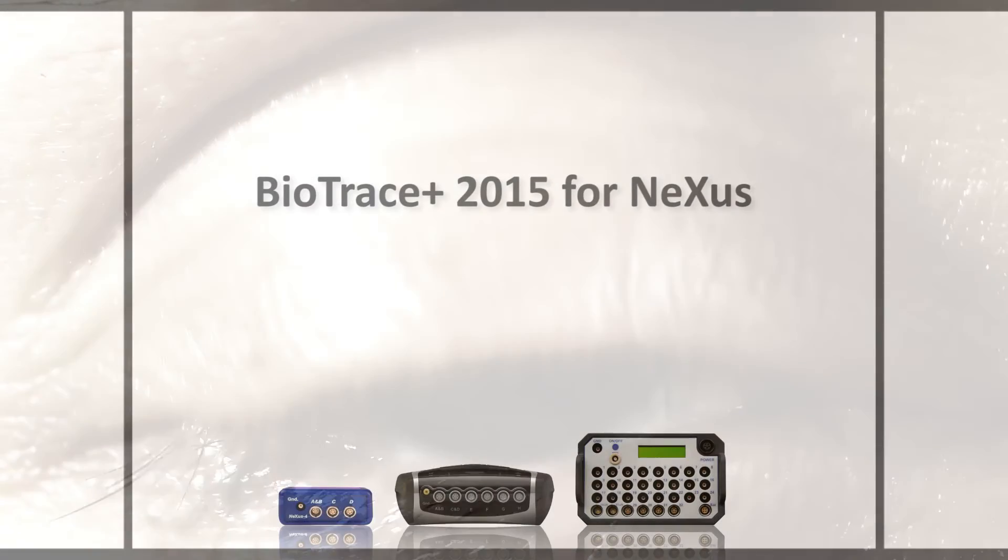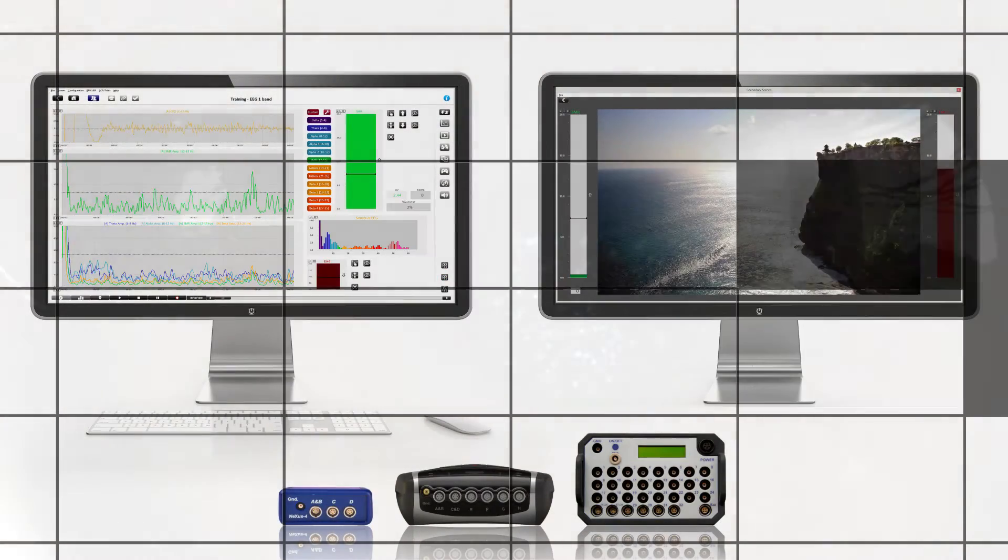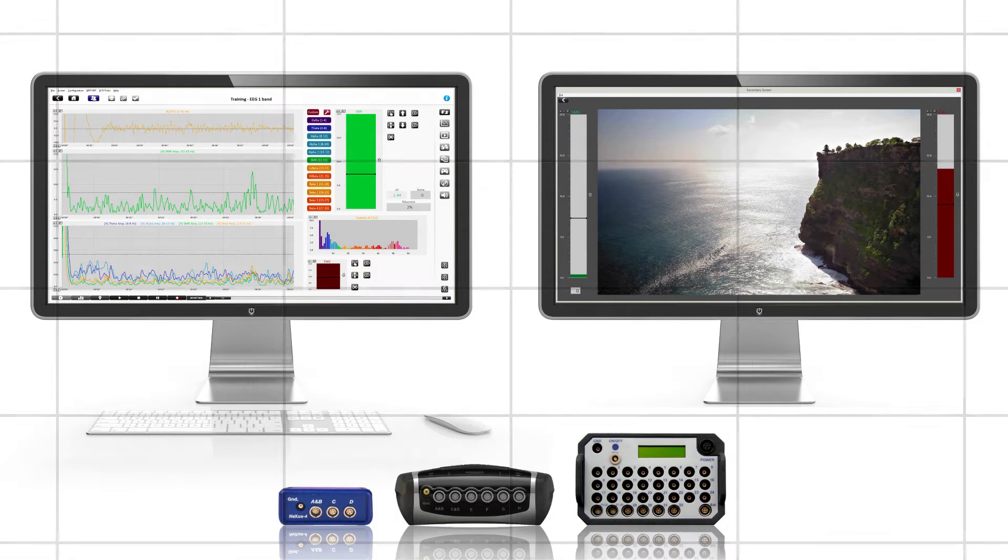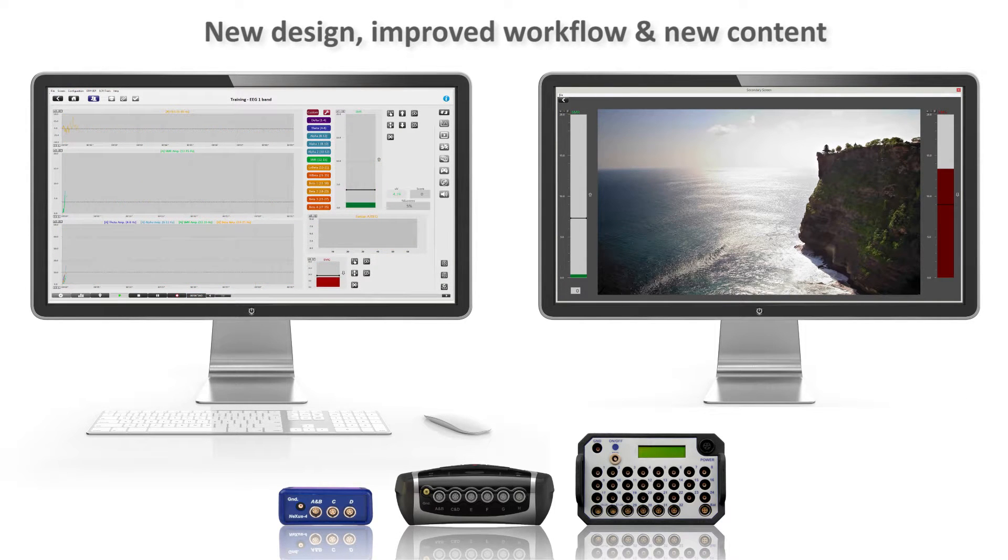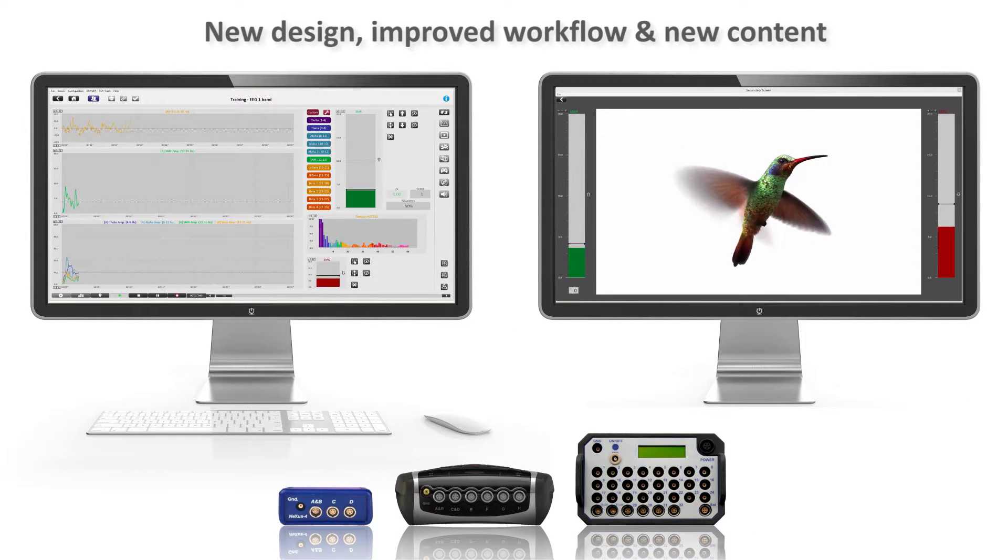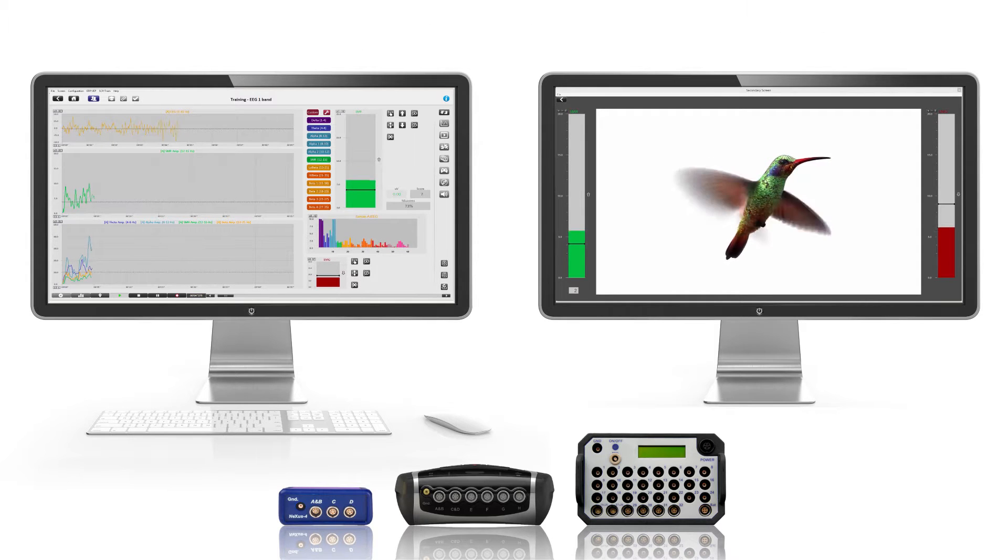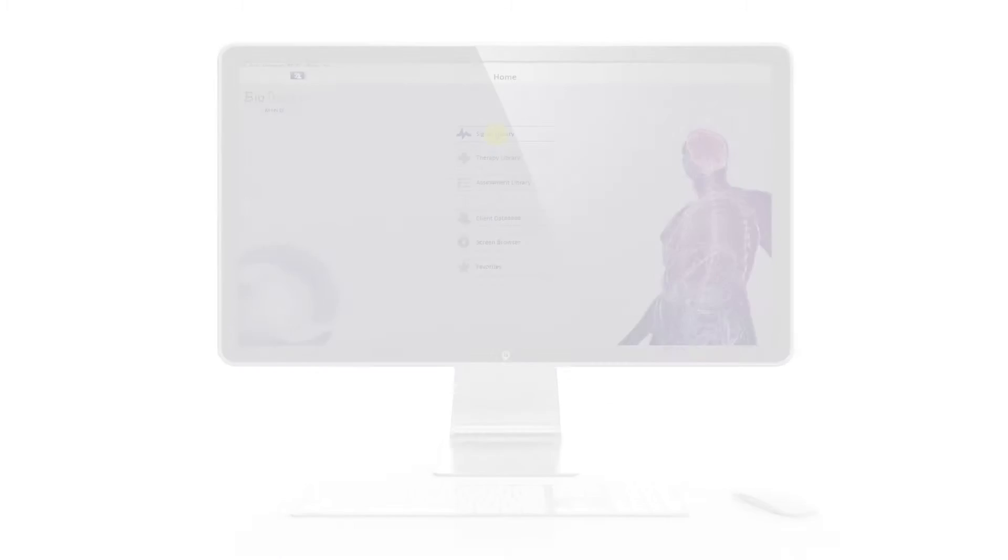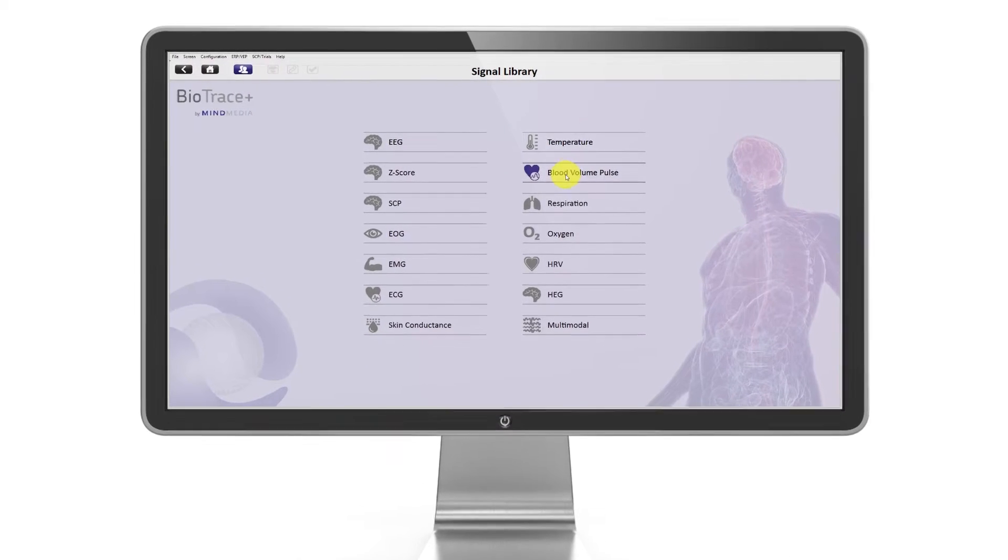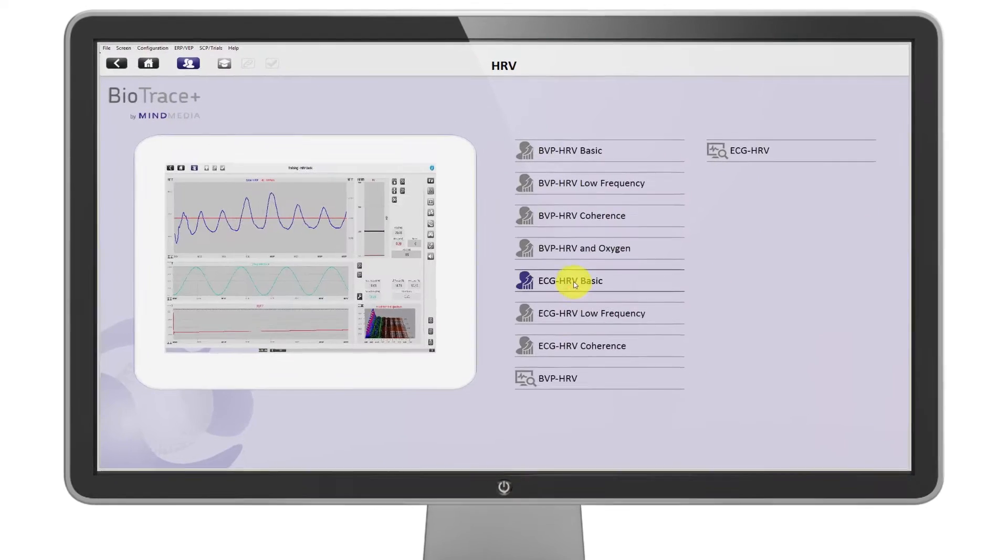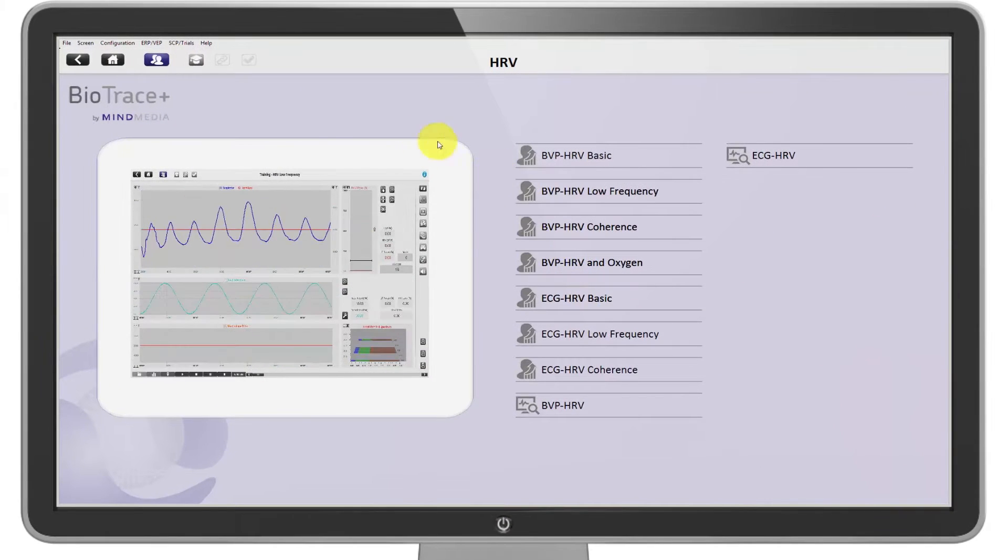Mind Media is proud to present the new BioTrace Plus software. This is a major update with a brand new design, improved workflow, as well as new content and features. With the new user interface, you can navigate the software as in a web browser by simply clicking on icons and buttons.